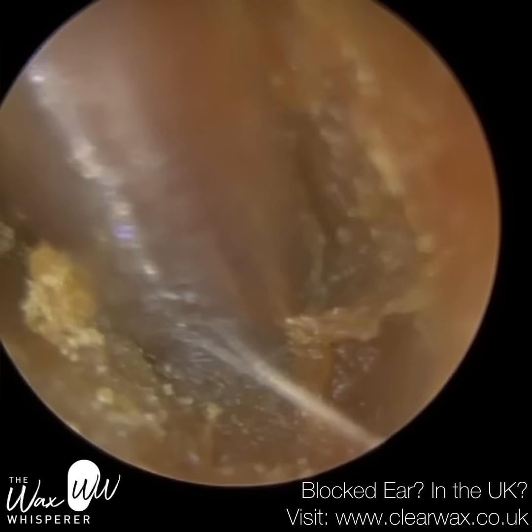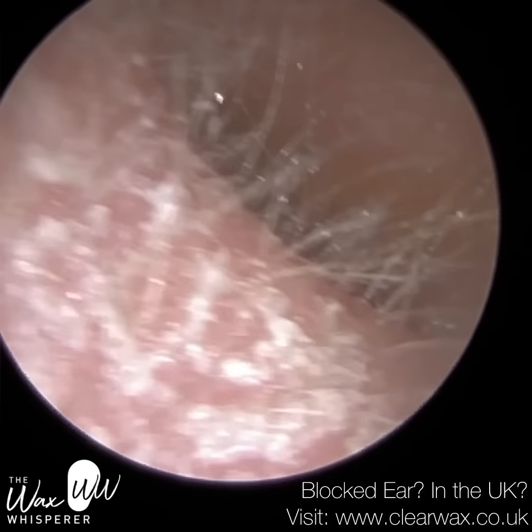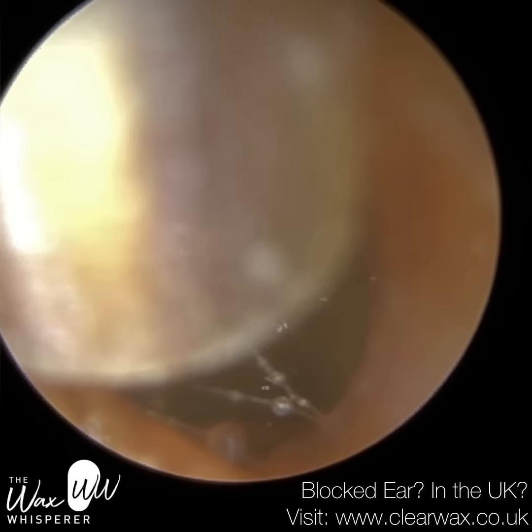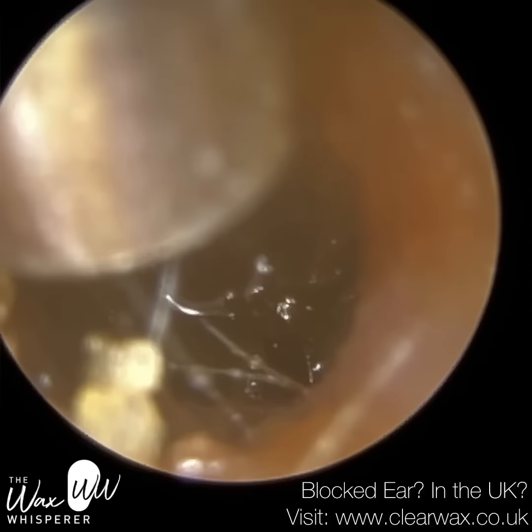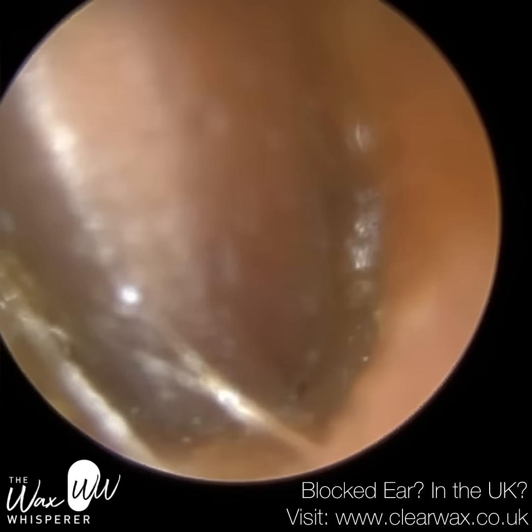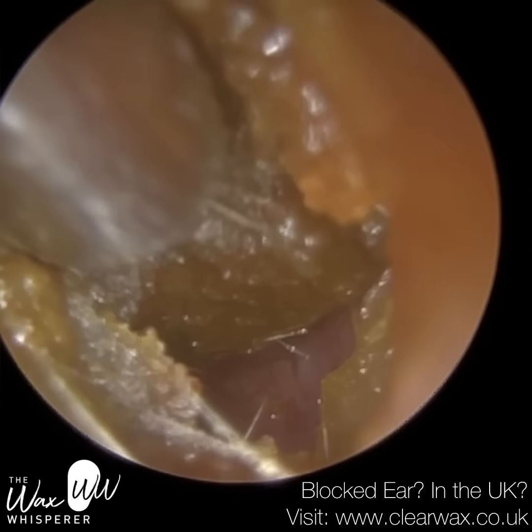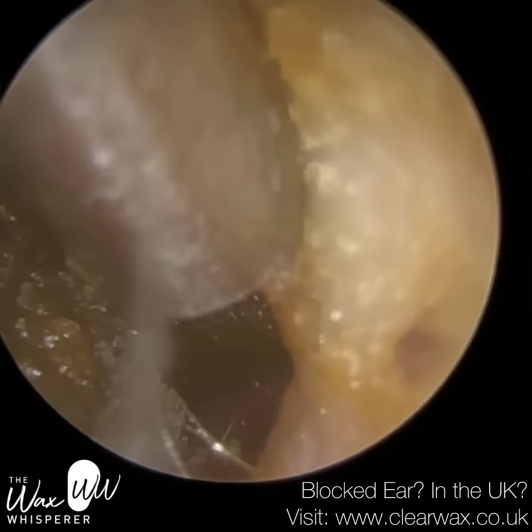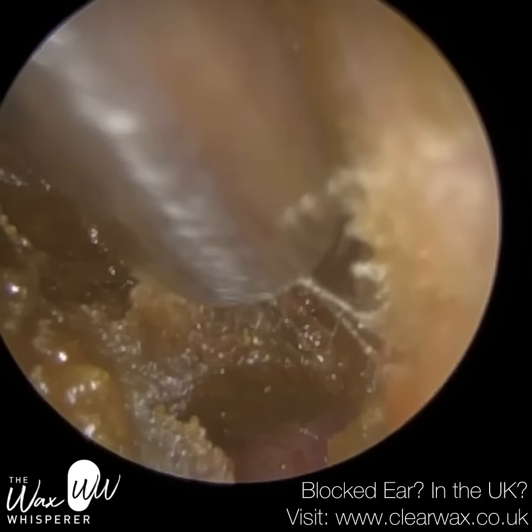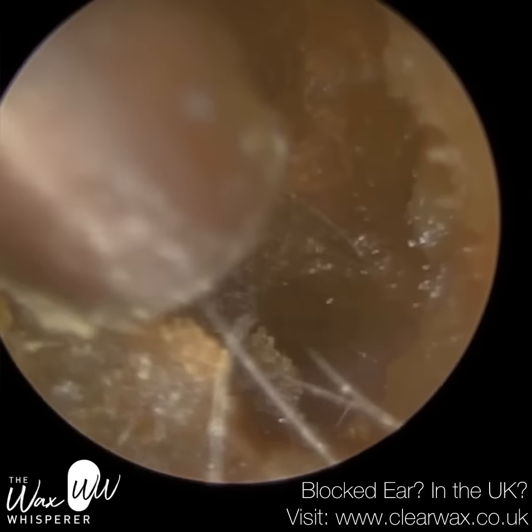As you guys know, the bony — the osseous part of the ear canal, so the inner two-thirds, the pars media and interna — it's very, very sensitive. The skin that lines the bony part of the ear canal is less than 0.1 millimetres in thickness, and it's the epidermal layer of skin. There's no dermis or hypodermis, also known as subcutaneous layers. There's no insulating fat there to buffer any contact we make, so we're literally skin on bone.